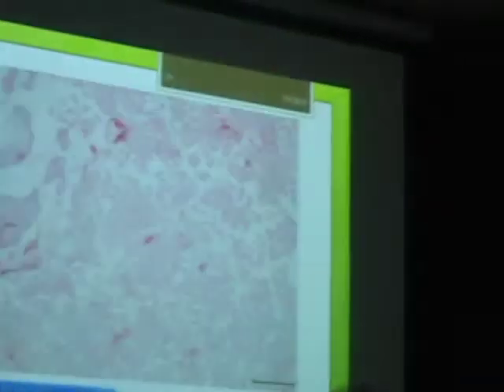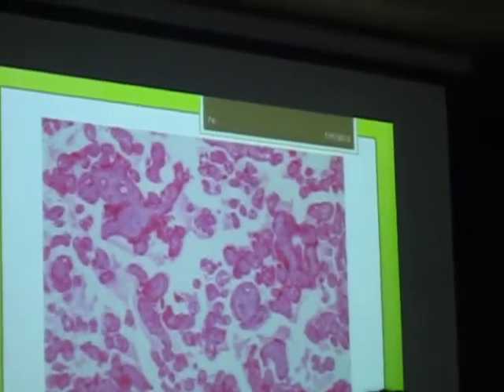Okay. Now classify the tissue. Classify the pointed tissue. Adipose tissue. Adipose tissue, correct. This is adipose tissue. You see, it is composed of lobules and sheets of mature adipocytes or fat cells. Okay, and the nucleus is on one side, so you have your signet ring appearance of your adipocyte or fat cell. Okay, it's clear because the fat dissolved during processing. Okay, next.